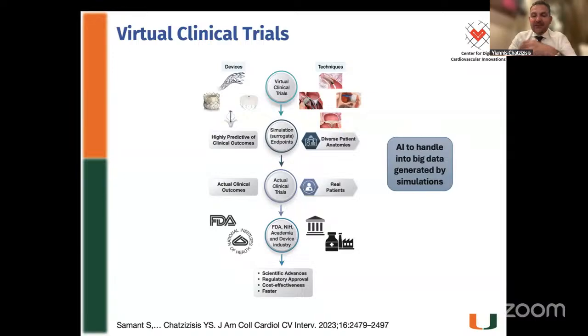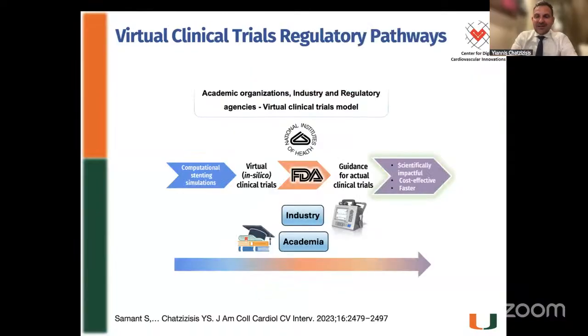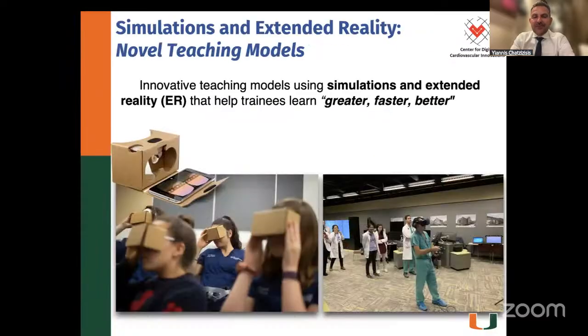The devices we have help essentially the process to advance new scientific knowledge in a very time and cost-effective way. And that's something that FDA prioritizes nowadays, because this approach, the in silico clinical trials, facilitating actual clinical trials, can help us with impactful scientific knowledge in a very time and cost-effective way. We learn more in a faster and cheaper way. And then the third application of the simulations, on top of planning of procedures, on top of virtual trials to accelerate the regulatory approval of devices.